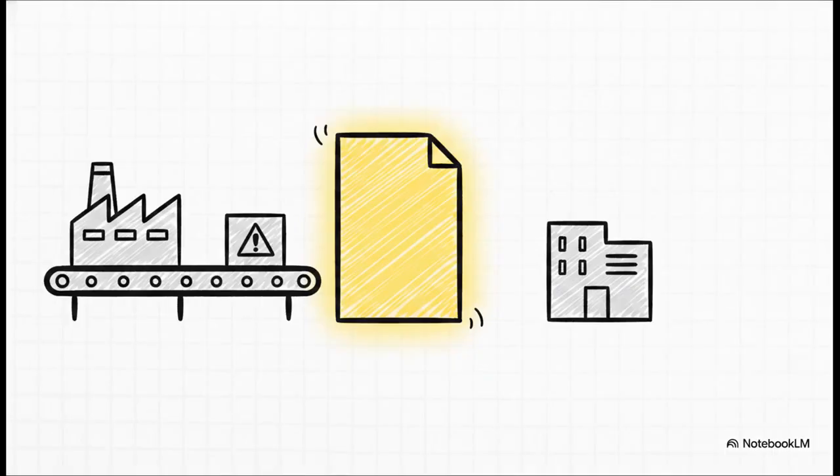Going back to our fictional NeoCath Secure example with a company called Meridian Medical. So Meridian outsources their EO sterilization. Their technical agreement lists the exact temperature and humidity limits, while their quality agreement strictly mandates prior notice of any changes. When that lid material changed back in scenario SC06, having that quality agreement in place totally protected Meridian. It ensured they were notified before unvalidated product ever hit the market. It just proves why prior notification and these agreements in general are legally critical.